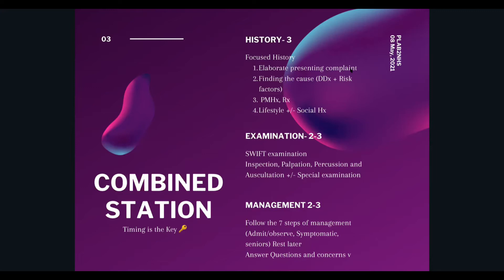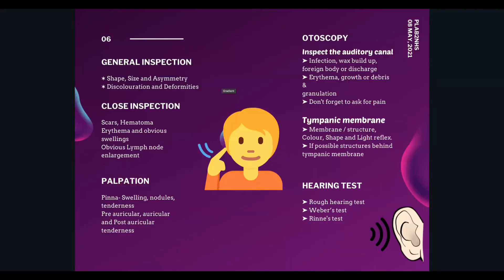Before starting otoscopy, hold the otoscope like a pen between your index finger and thumb, resting the handle near your hand. Always start with the normal ear first, then proceed to the abnormal ear. During the stress of an exam you may forget which ear is affected, so always cross-check before proceeding.